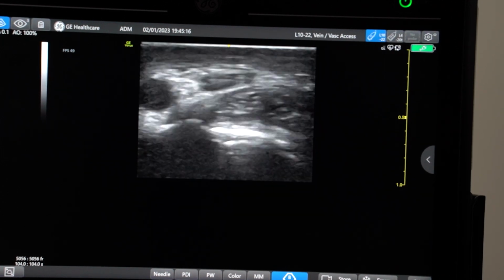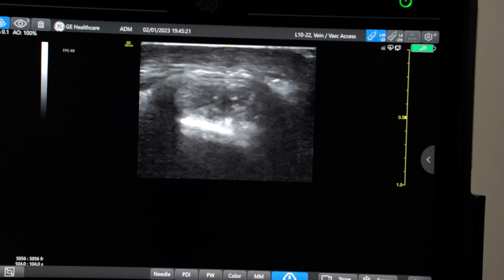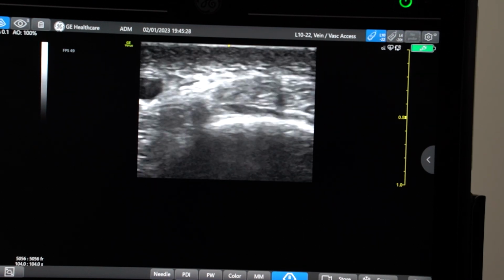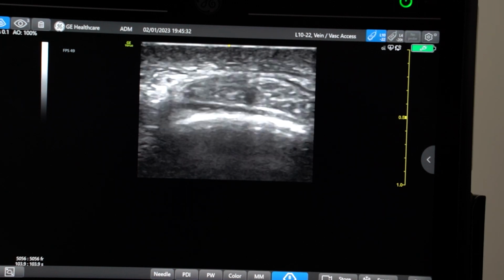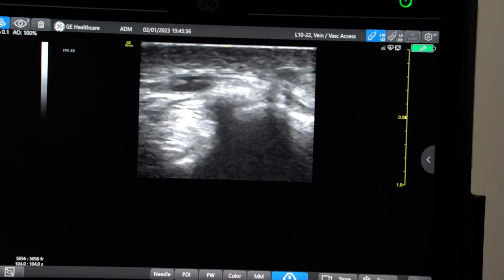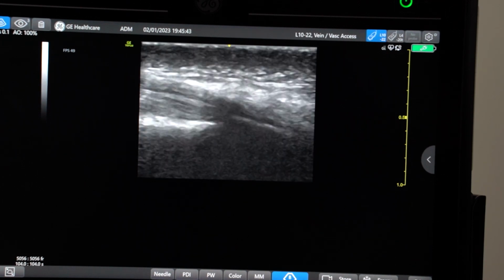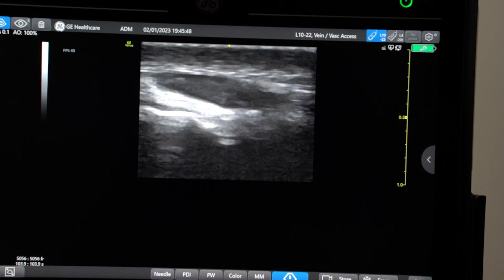So that's a vein. Just to the side of it there is a tendon, and as I move my thumb, you can see that tendon move. And this is one of the big advantages of ultrasound imaging, is that you can do dynamic imaging, so you can be able to move and manipulate things. I'm looking at that vein, for instance, in cross section currently, but actually I can just as easily turn my probe around. So that's the same vein now, but it's now running longitudinally.